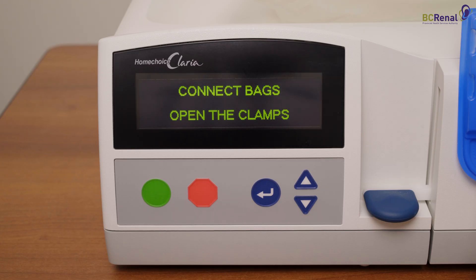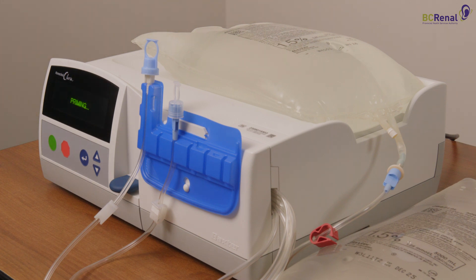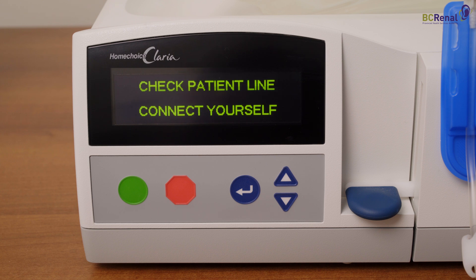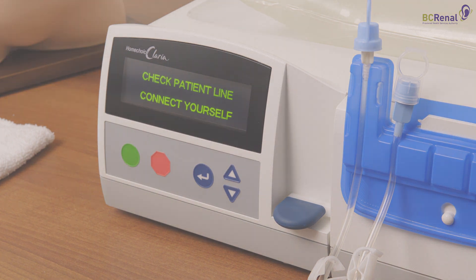You are now ready to prime the Cycler. Press the green button. The Cycler screen will say 'priming.' The priming process clears all lines of air and takes approximately 10 minutes to complete. When priming is complete, the Cycler will say 'check patient line — connect yourself.' The Cycler is now ready for use and will wait until you are ready to connect and begin your therapy.